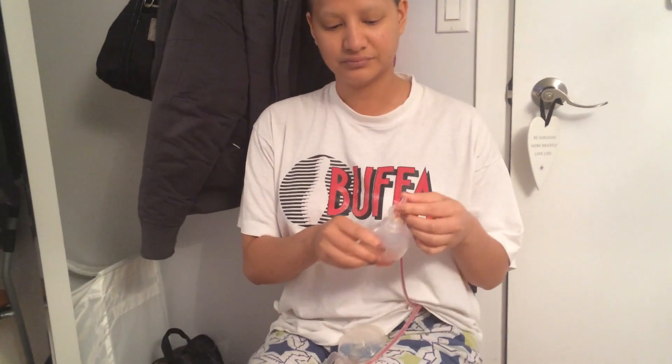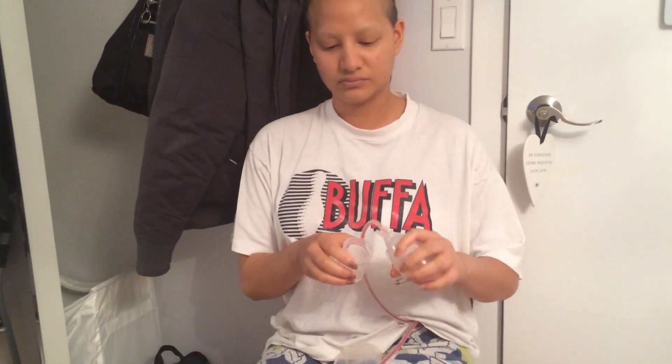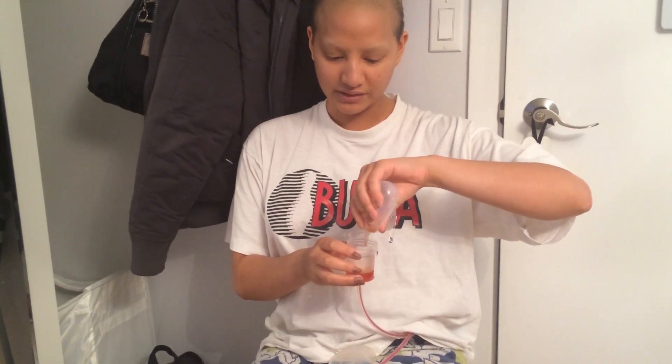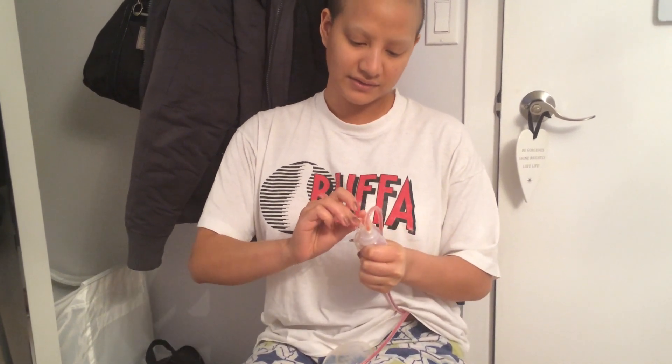Before closing the valve, you're gonna squeeze out all the air, and then close it. Then you do the same with number two: squeeze the tip of the tube, open the valve, squeeze out all the liquid, squeeze out all the air.